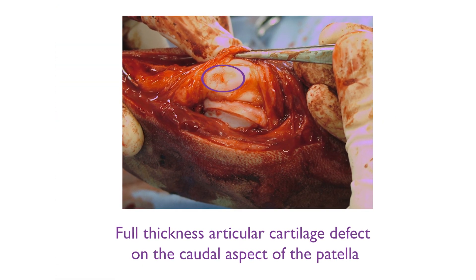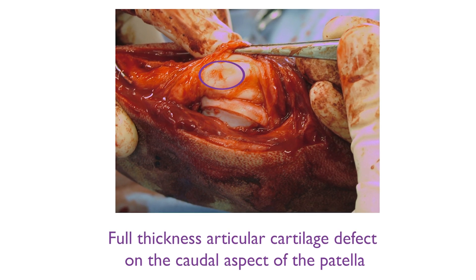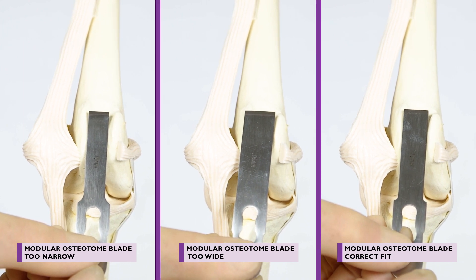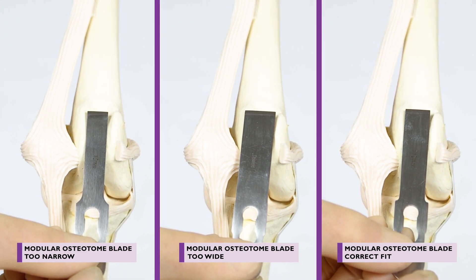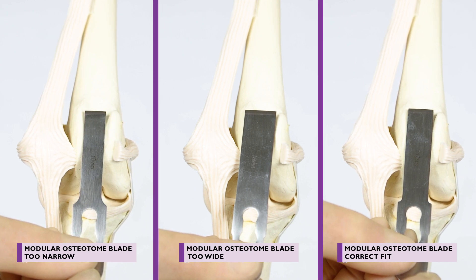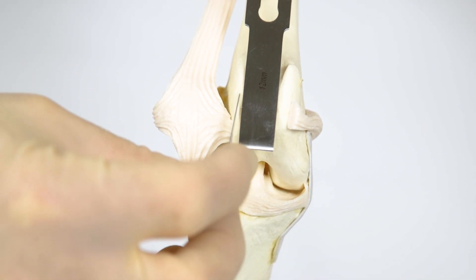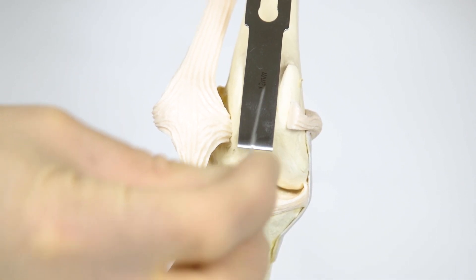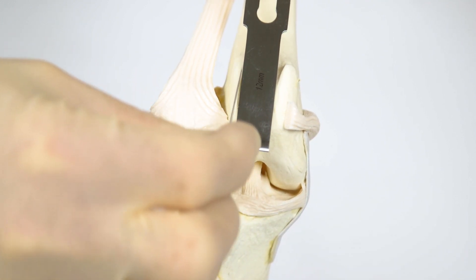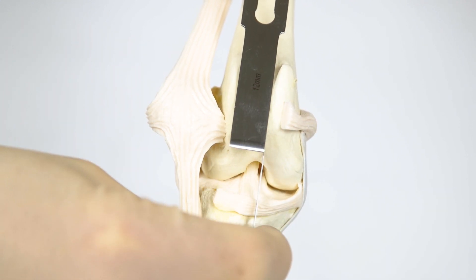The caudal aspect of the patella should also be inspected for damage to the articular cartilage. A modular osteotome blade is chosen that best fits the maximum width of the trochlear groove. This will determine the width of the intended sulcoplasty. A number 11 scalpel blade is used to gently score the intended cut position on the medial and lateral trochlear ridges. These should be positioned such that there is sufficient ridge width remaining, but that the block will be as wide as possible.